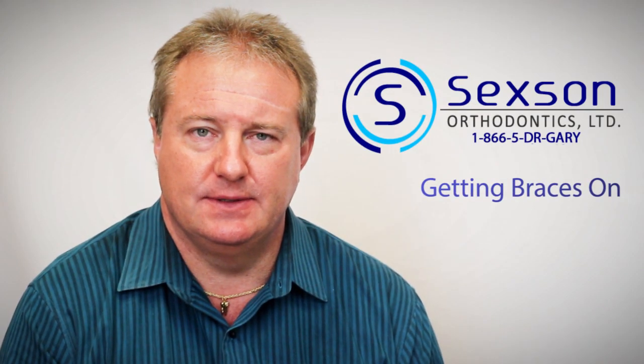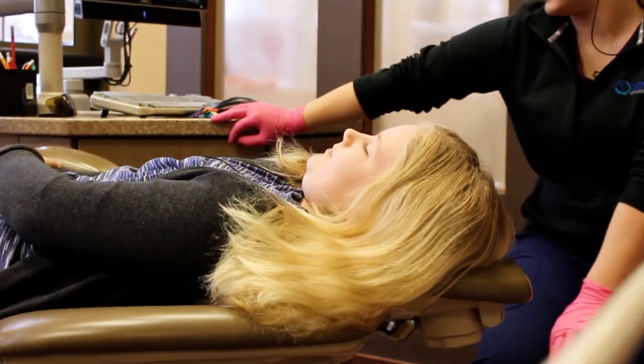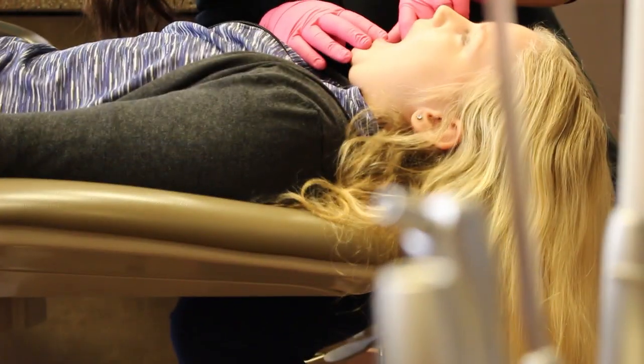The appointment to actually get the braces on is kind of a lengthy appointment, probably the longest appointment you'll ever have with us. The first thing my assistants will do is they'll polish the teeth, make sure they're really clean.